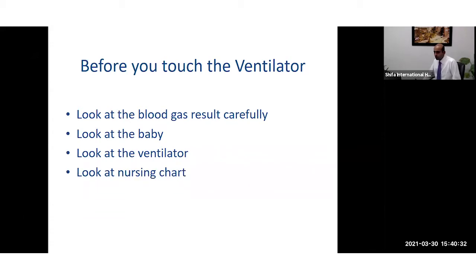And look at the nursing chart to see how long ago the suction was done. Does the baby need suction? So before adjusting anything on the ventilator and touching any knob, we should be looking at all these things carefully, and only then adjust any of the ventilation parameters.